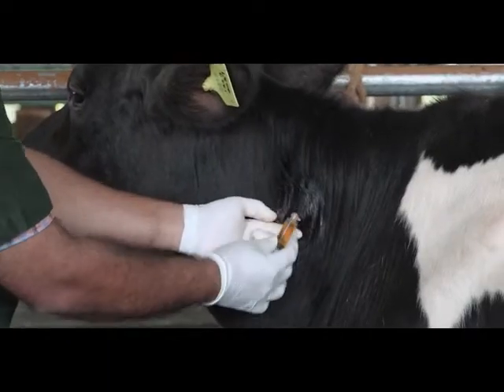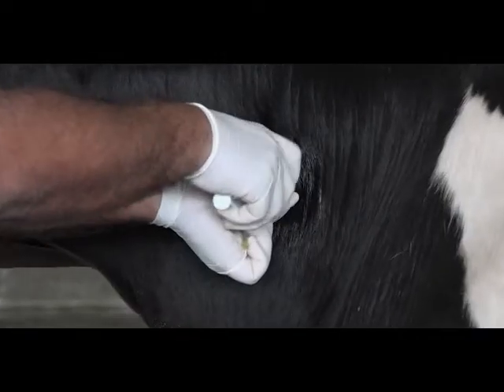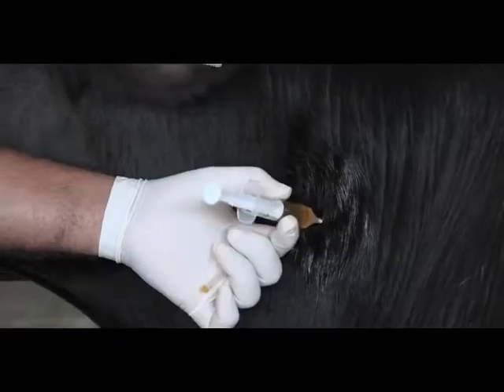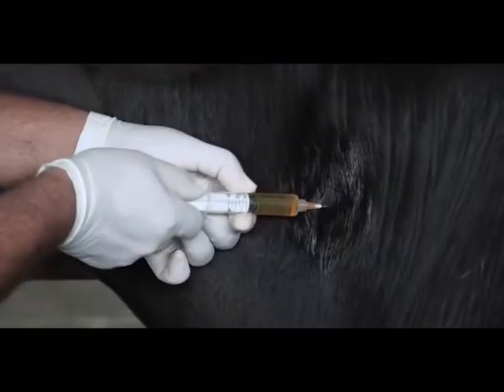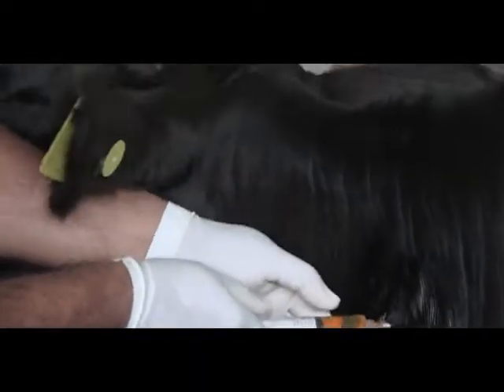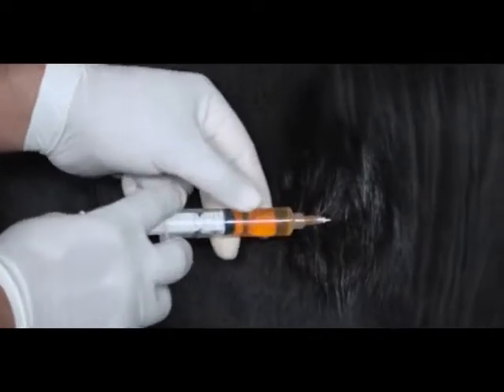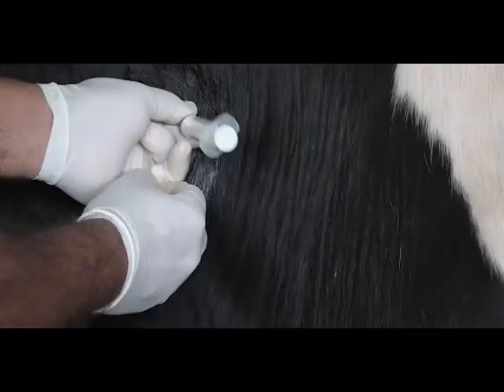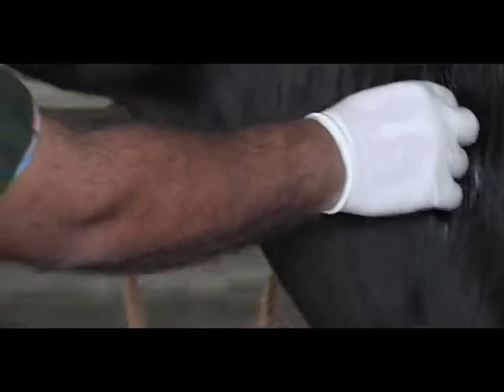Then fix the syringe to the hub of the needle, and aspirate to make sure blood is not coming out. Then press the plunger to release the drug into the muscle. Before withdrawing the syringe, apply some pressure using a cotton wool swab at the injection site.